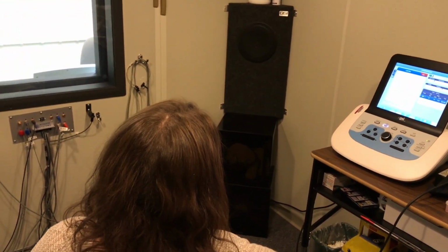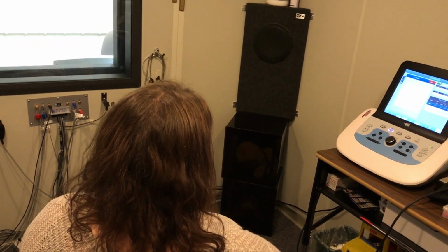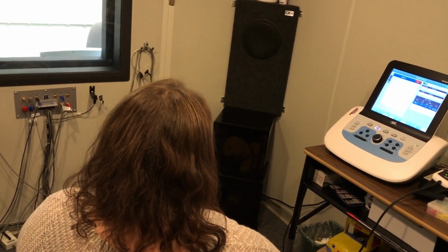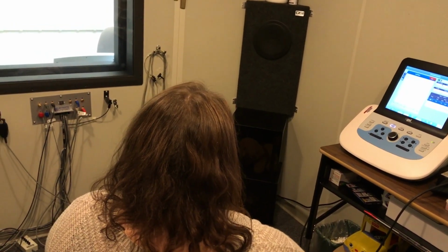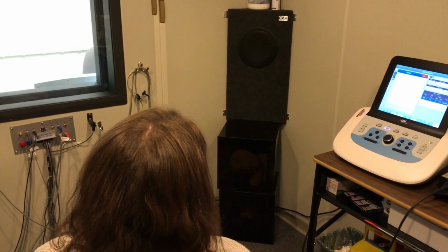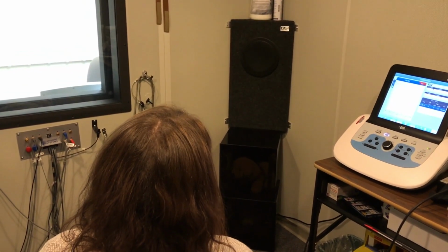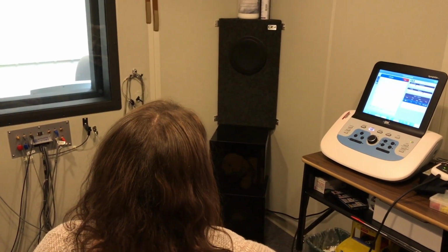Okay, you'll listen to a story through a loudspeaker. First, we'll turn the volume up until you signal that the story is too loud. Then we'll turn the volume down until you signal the story is too soft. Finally, we'll adjust the signal until you tell us the signal is the loudest level that is most comfortable for you.